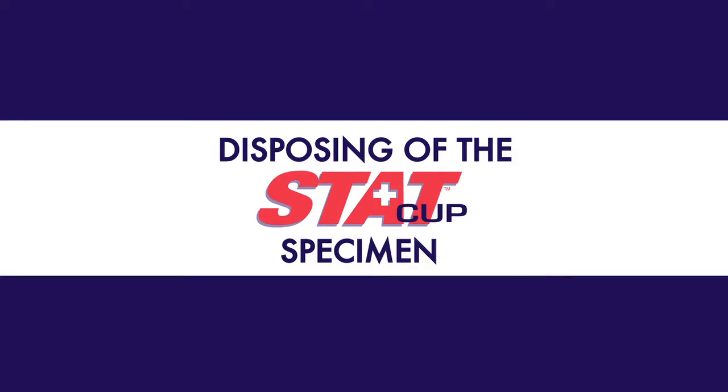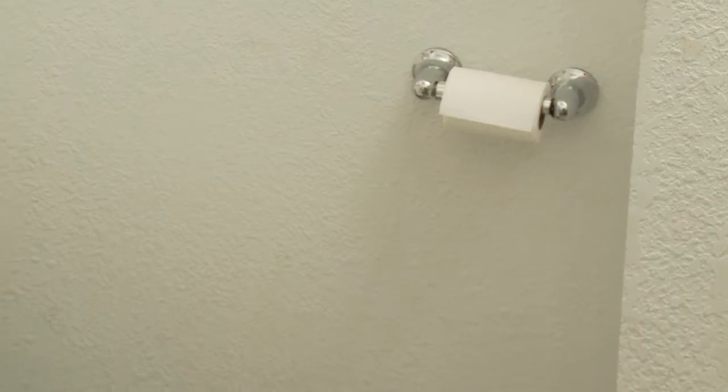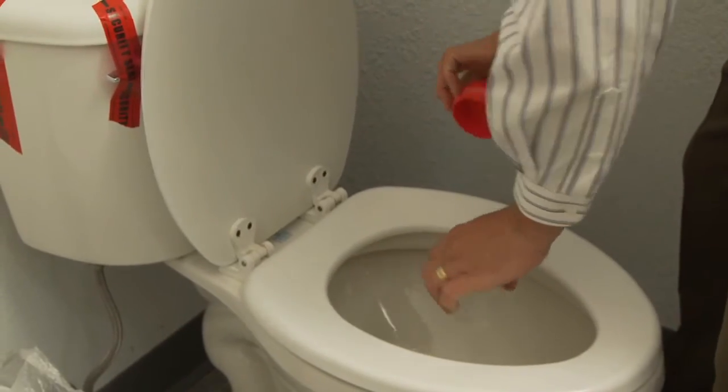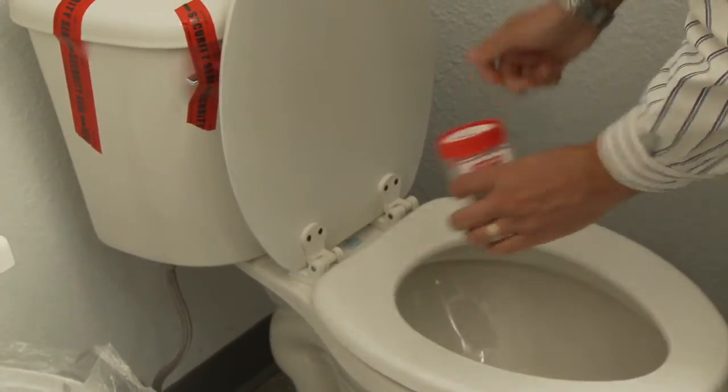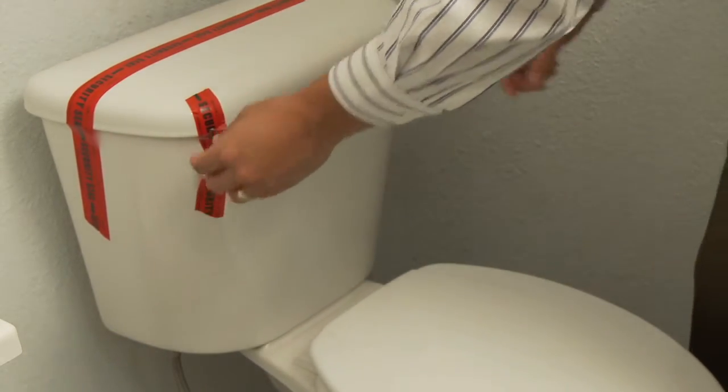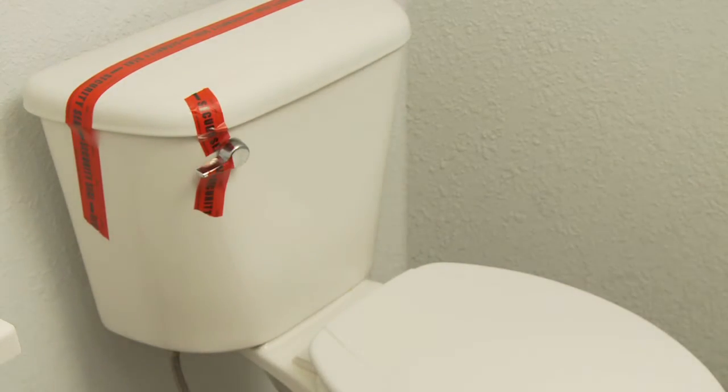Disposing of the StatCup specimen. When it is time to dispose of the StatCup specimen, instruct the donor to take the StatCup back to the restroom, remove the lid, pour the remaining specimen into the toilet, and flush it. The lid should be returned to the device, and the device should be discarded in the trash can.